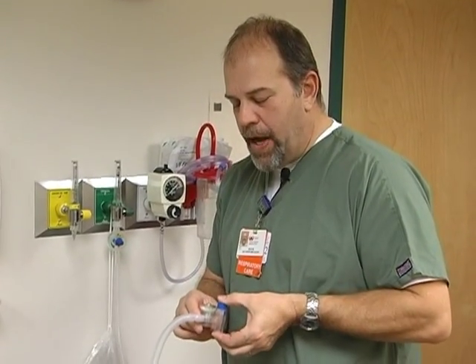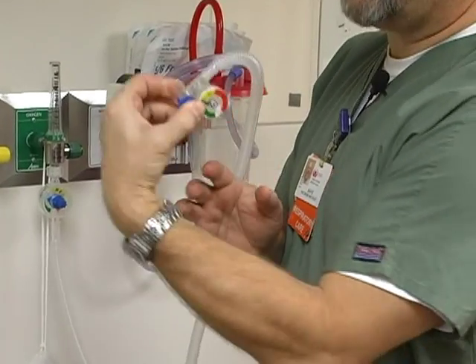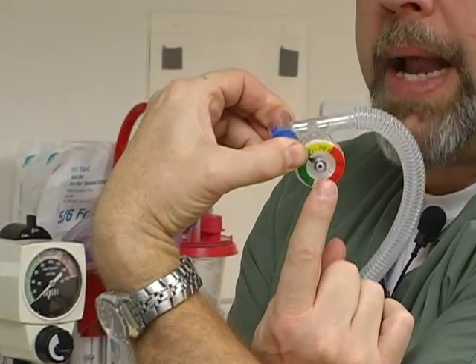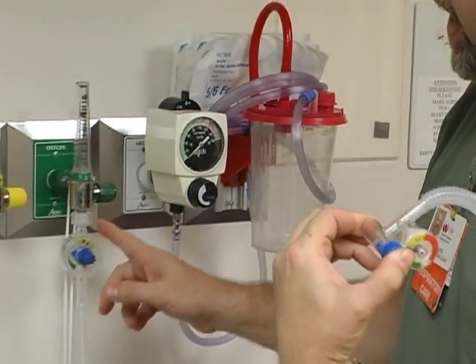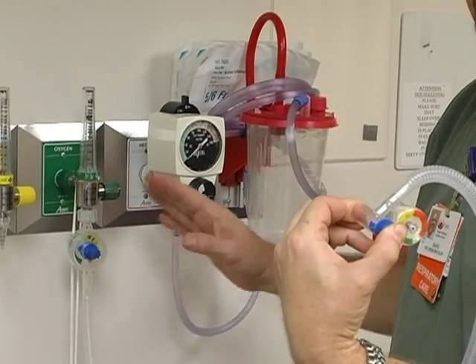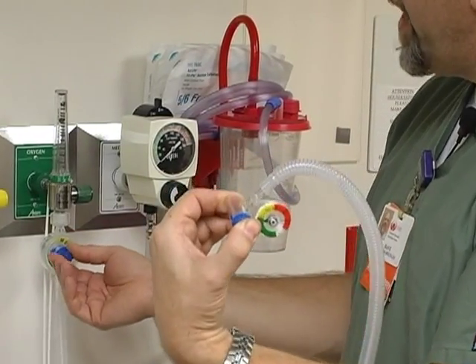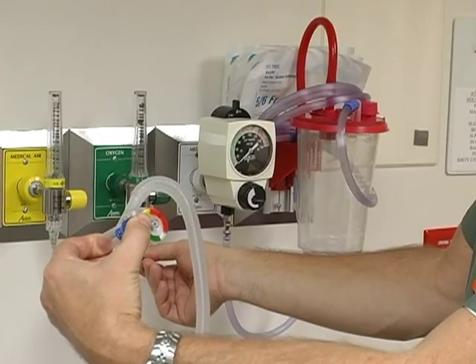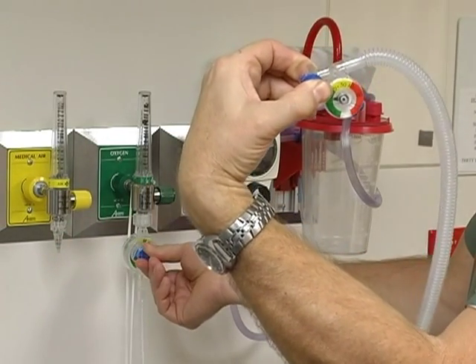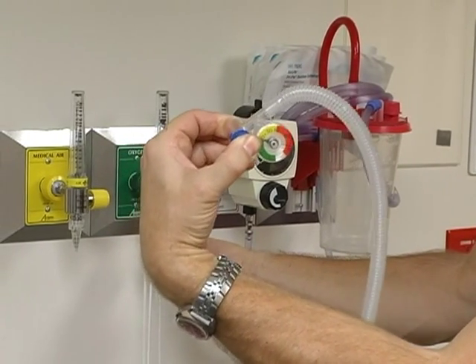This operates the same way as the Neo-Puff: you take your finger and thumb and occlude the T-piece of the Neo-T. This is our manometer right here. You turn back here — again we have green, yellow, and red for the lower, medium, and higher pressures on both the controller and the manometer. You take the controller, watch your manometer, and adjust to whatever pressure you desire. If we want 20, you set it at 20.